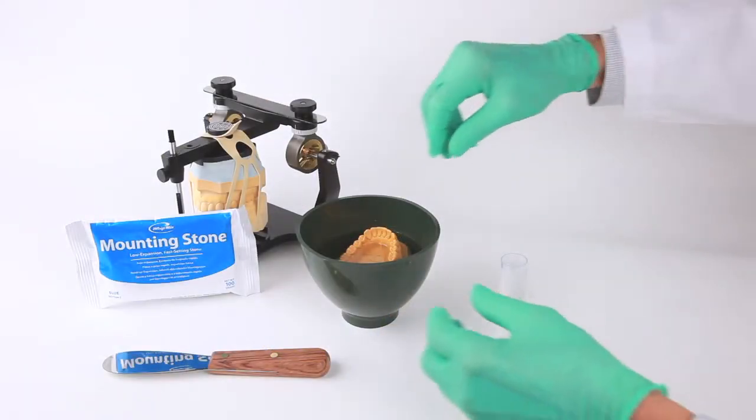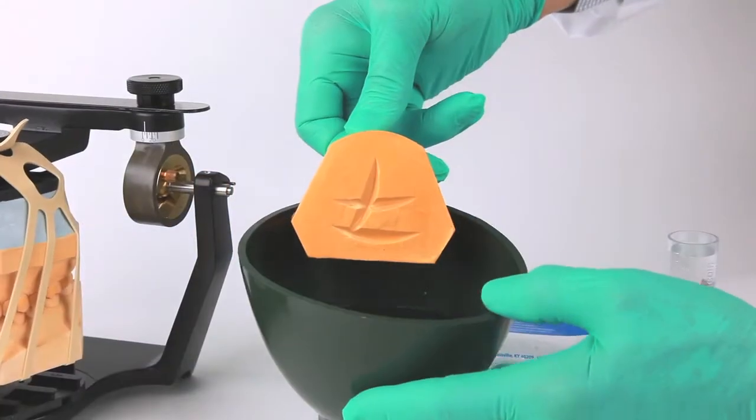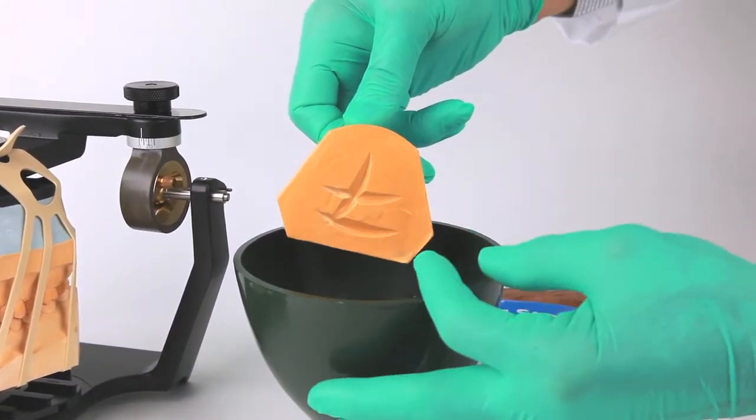To ensure adequate mounting strength, the cast should be soaked in water for 2 to 3 minutes and the base scored or notched to obtain maximum adhesion of the mounting stone to the cast base.